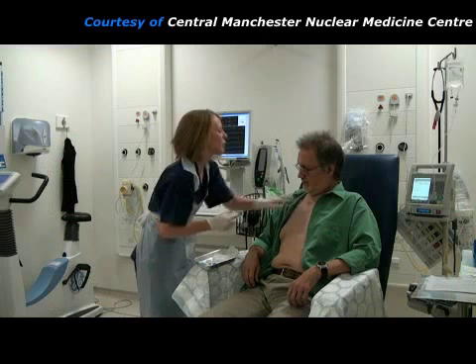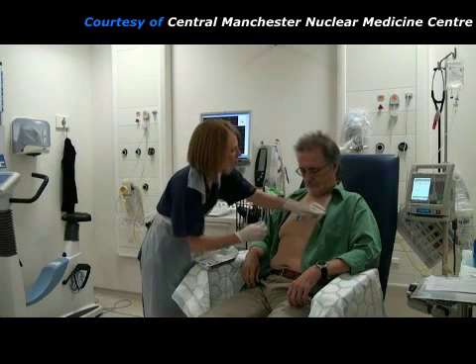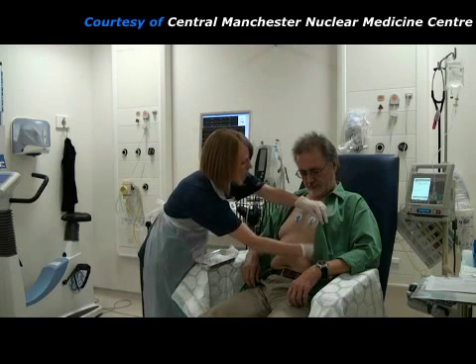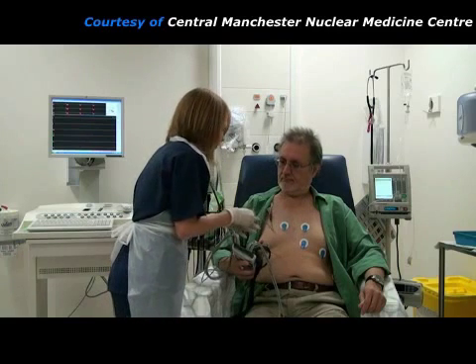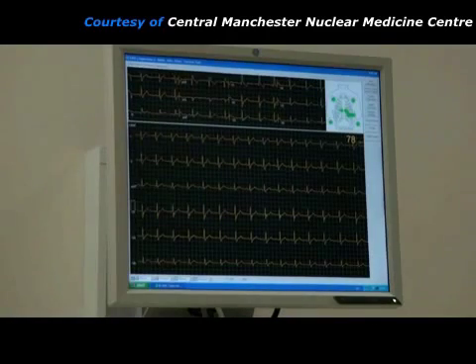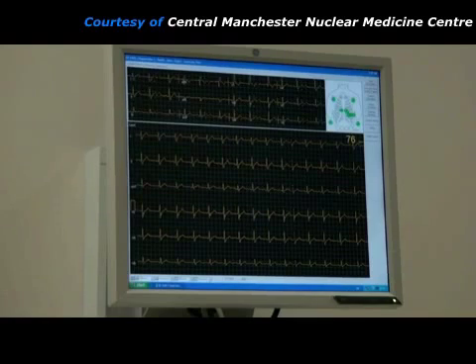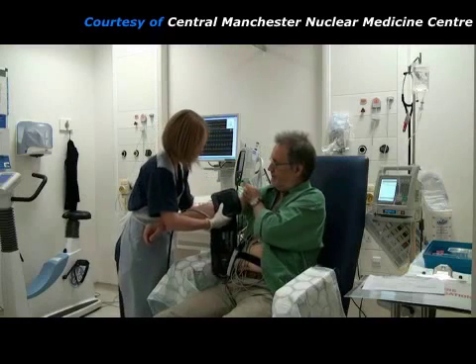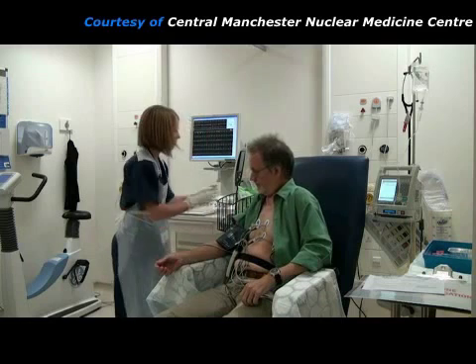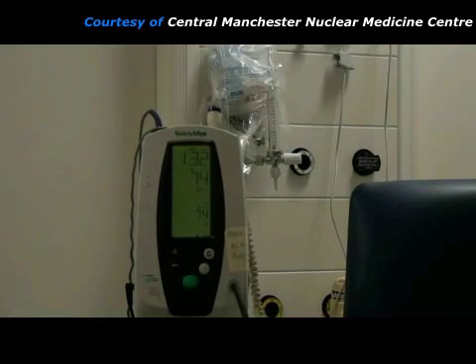The practitioner places some adhesive electrode pads onto the patient's chest. These will be used to connect the ECG machine, which will monitor the patient's heartbeat. There are 12 wires to connect the electrodes to the ECG machine. The ECG shows the patient's heart rate and tells the practitioner whether it is beating normally. An inflatable cuff placed around the patient's arm is connected to a blood pressure monitor, which will show any abnormal change in blood pressure during the procedure.